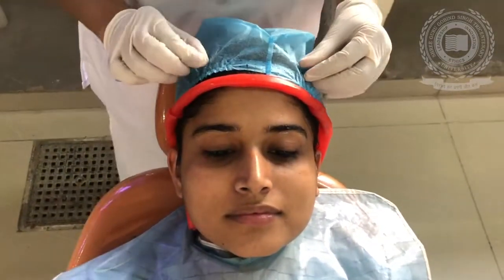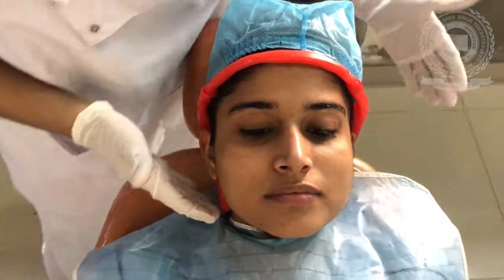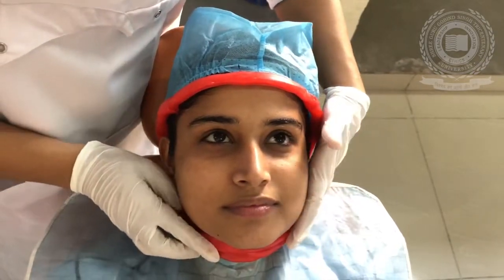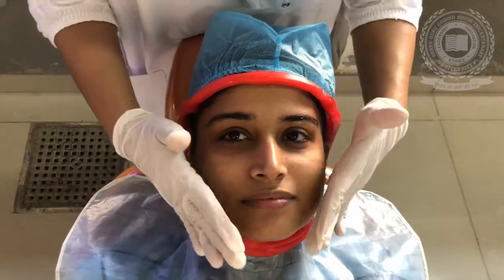Care should be taken that this bead does not distort, especially the ear positioning of the patient. We will also place a wax bead in this area. So, we have placed a wax bead around the face of the patient. We are going to limit our impression till this area — behind the ears and below the chin. Now we will mix the alginate and start placing it over the face of the patient.